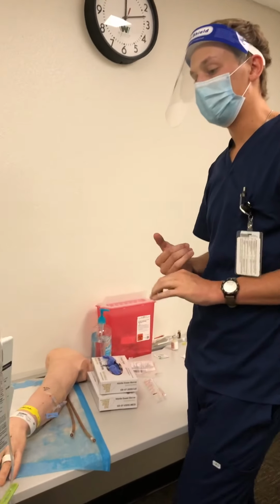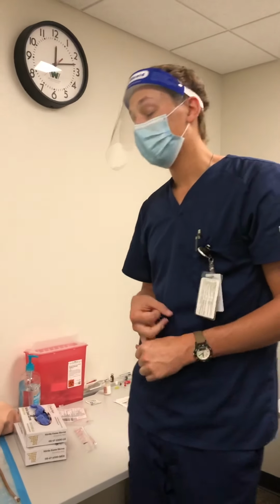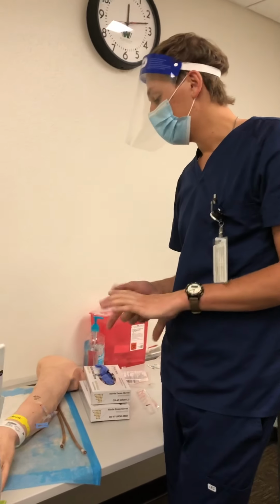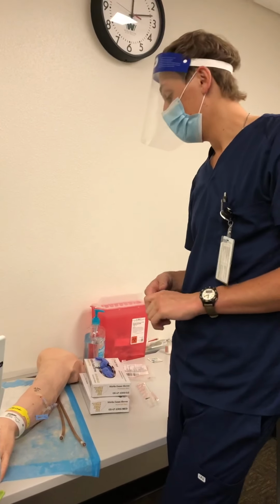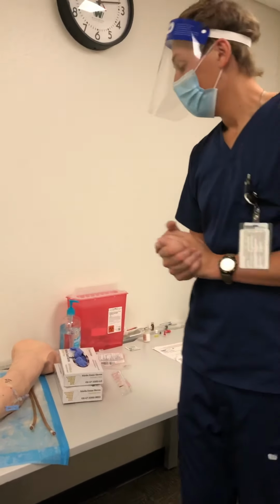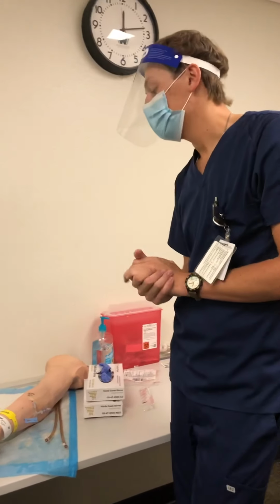So I'm going to document whether I used a pump or gravity tubing, the flow rate, the medication, how much I've administered, the rate. I'm going to look at before, during, and after the administration of the medication for the site to make sure it's not infiltrated or anything like that, and how the patient tolerated the entire procedure.